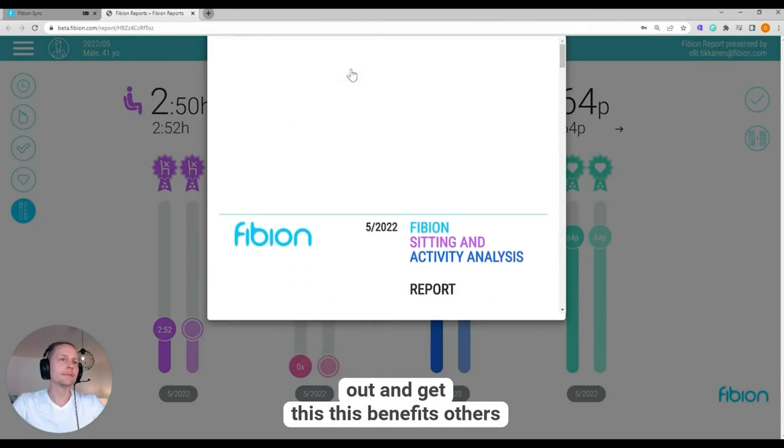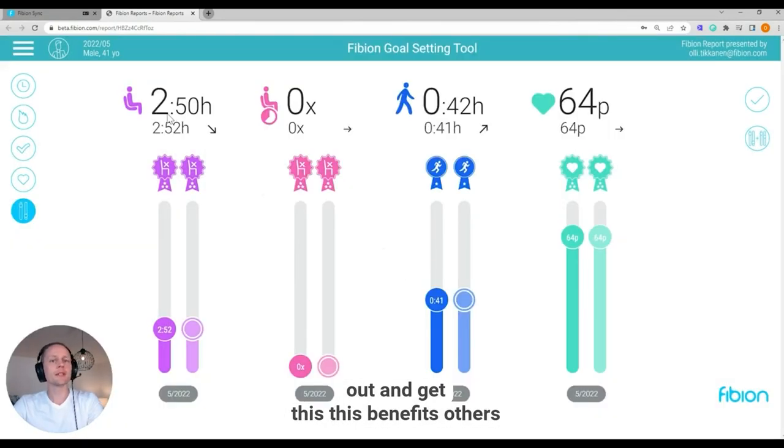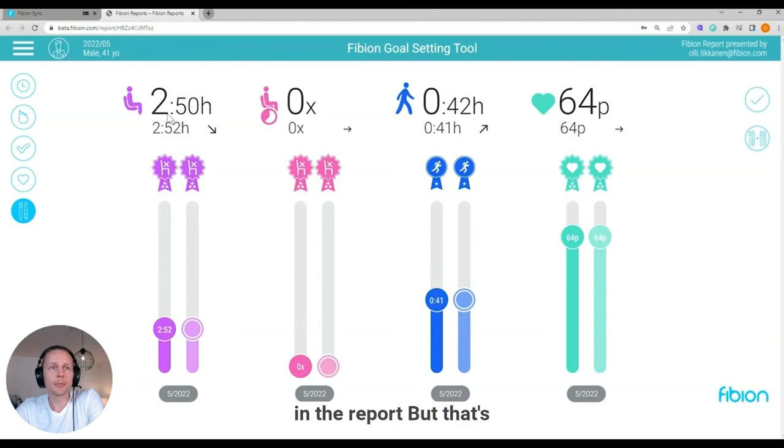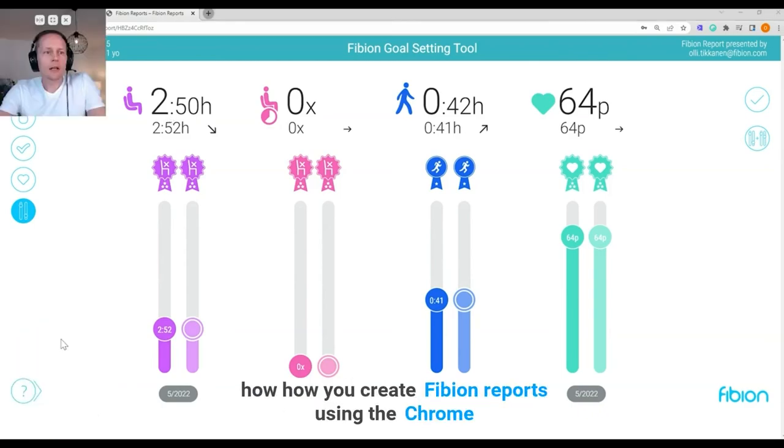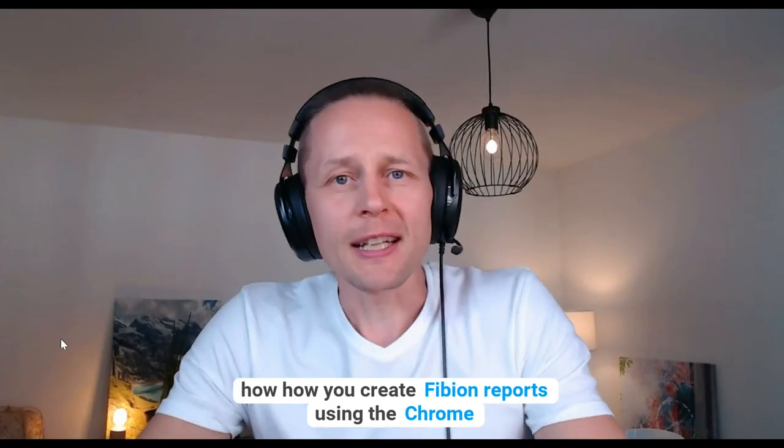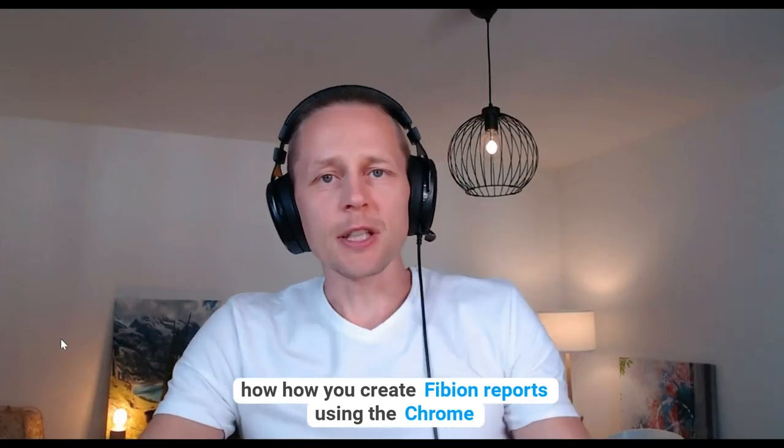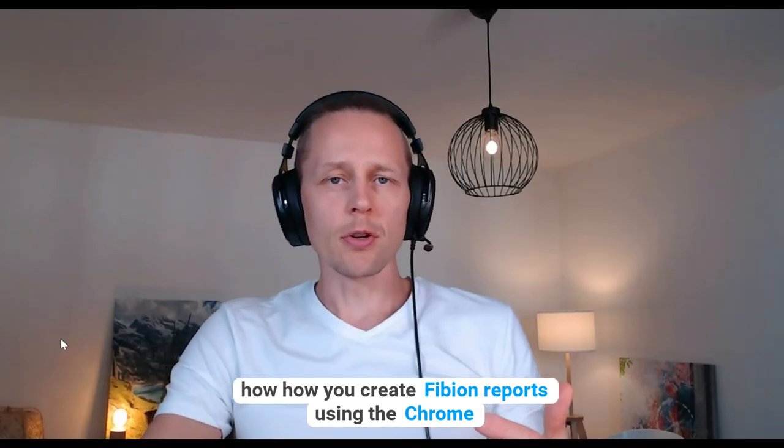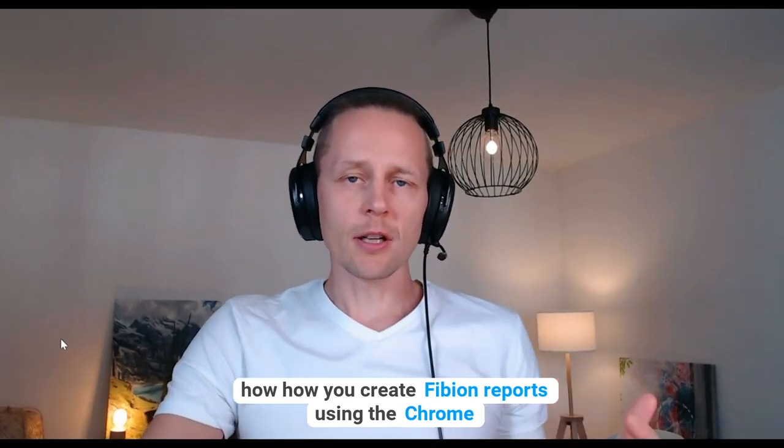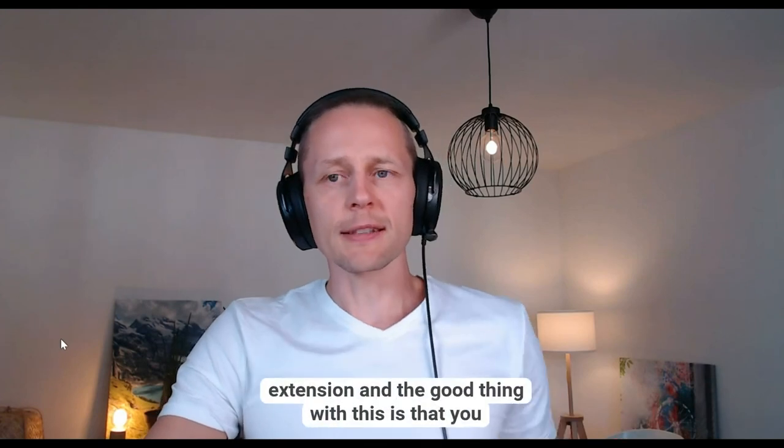And yeah, there's many features in the report. But that's how you create Fibion reports using the Chrome extension.